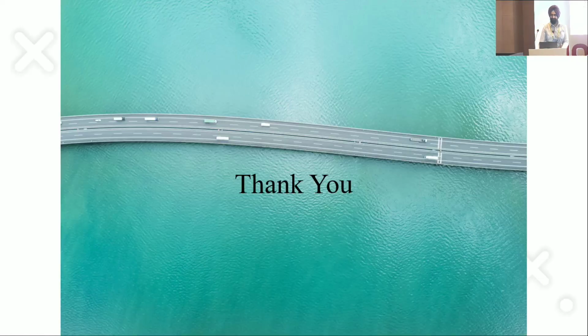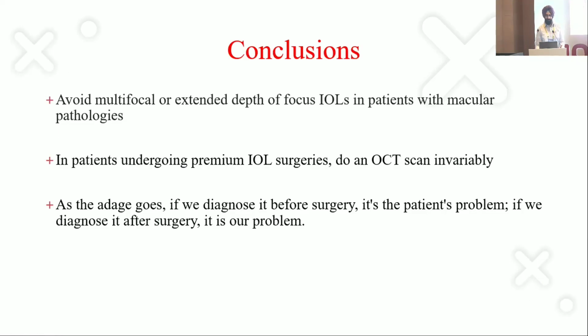So I'll conclude by saying, avoid multifocal or extended depth of focus IOLs in patients with macular pathology. In patients who are undergoing premium surgeries, do an OCT invariably. And as the saying goes, if we diagnose it before surgery, it's the patient's problem. But if we diagnose it after surgery, it's our problem.